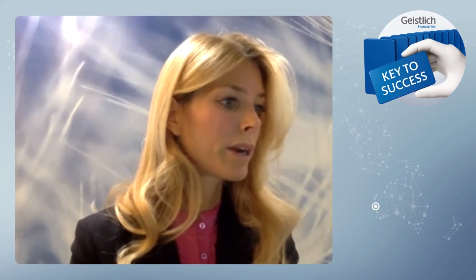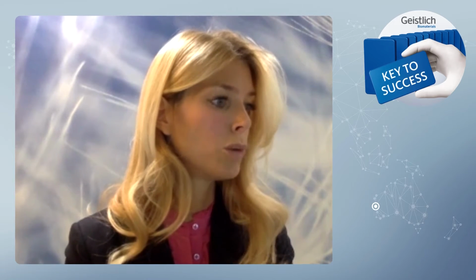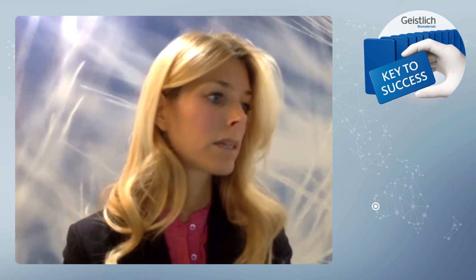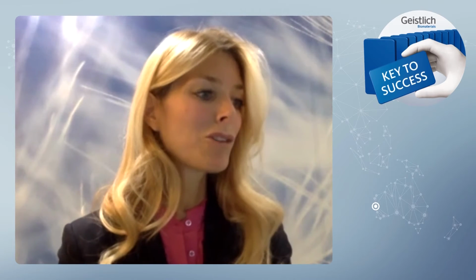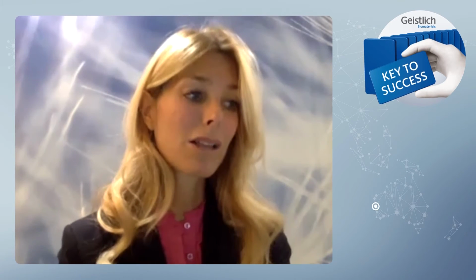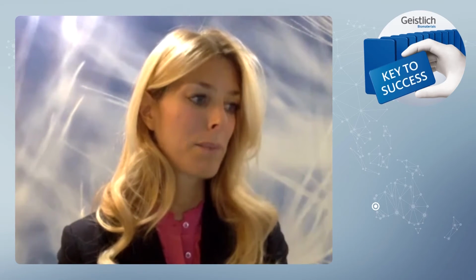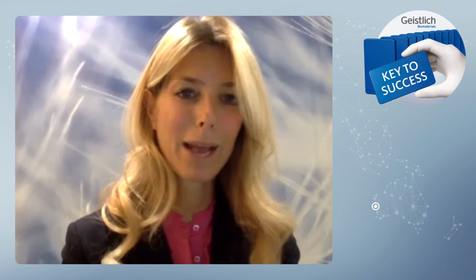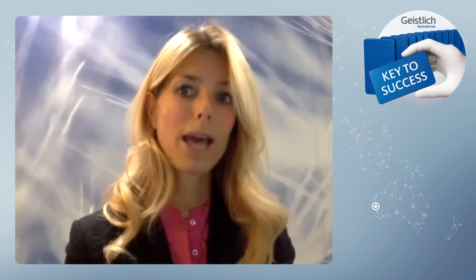Thank you very much. In situations where gross posterior ridges are rebuilt, we often will lose sulcus depth. Absolutely correct. How do you manage the situation where the sulcus depth is lost due to the coronal advanced flap closing over the large graft? You are absolutely correct. And it is a big issue.